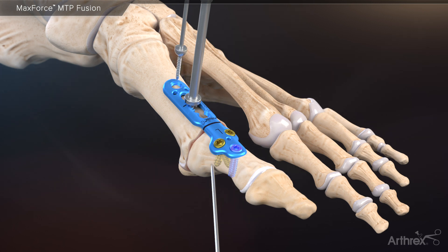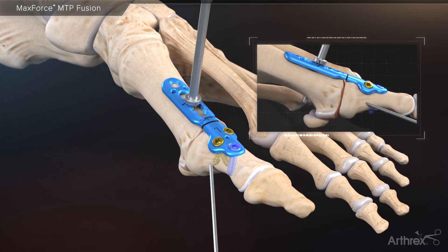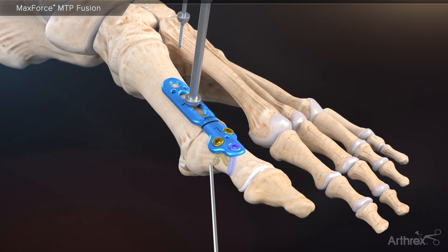Once engaged, proceed to remove the proximal BB tacks. Now, while maintaining the desired position of the toe, turn the compression tool with two-finger tightness in a clockwise fashion until an endpoint is reached and maximum compression is achieved. Maintain the position of the compression tool and reinsert a BB tack in one of the smaller BB tack holes in the plate. Utilization of the MaxForce compression tool allows surgeons to achieve an average of 25 pounds of compression through the geared mechanism.